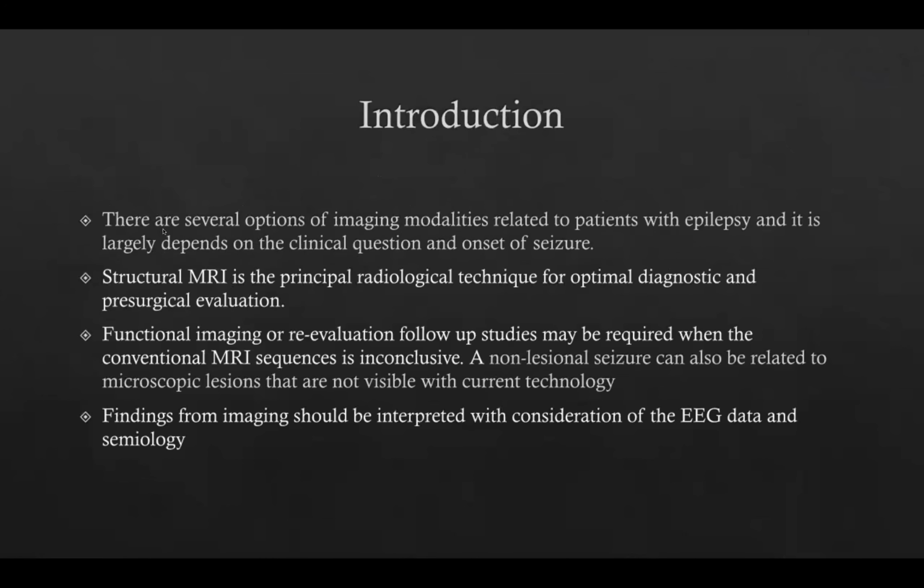Basically there are several options of imaging modalities for patients with epilepsy, and it largely depends on the clinical questions, the indications, and also the onset of seizure. For emergency, the more familiar imaging modality for most of you would be CT scan, but actually CT has a limited role in looking for the structural causes of epilepsy.